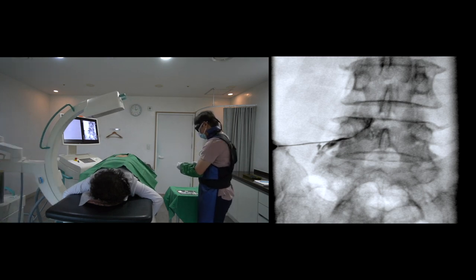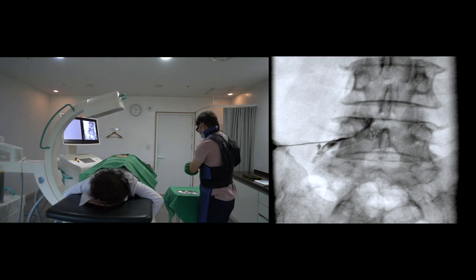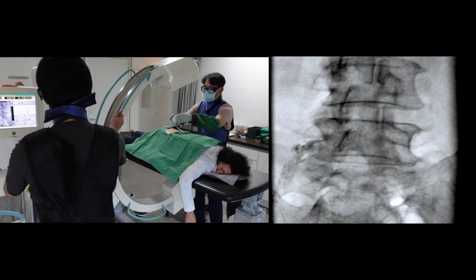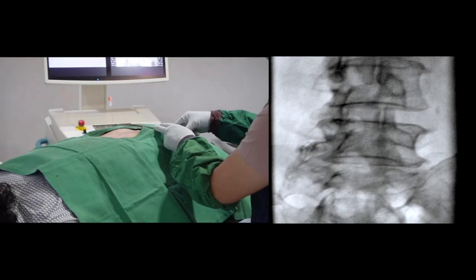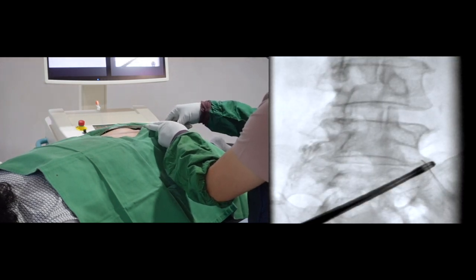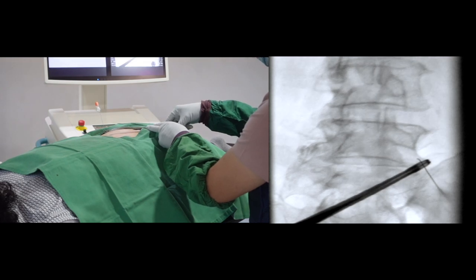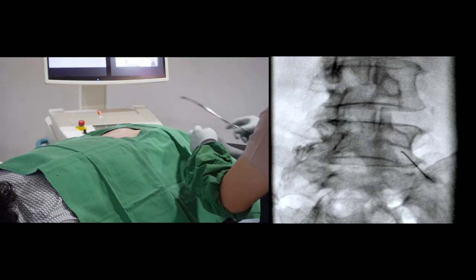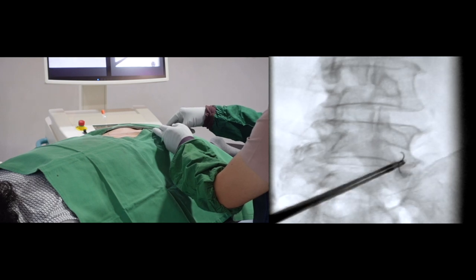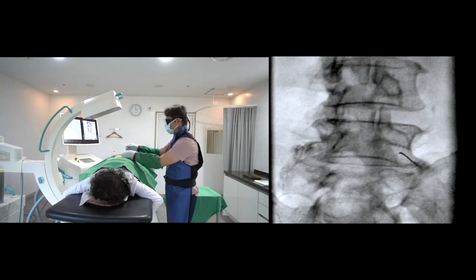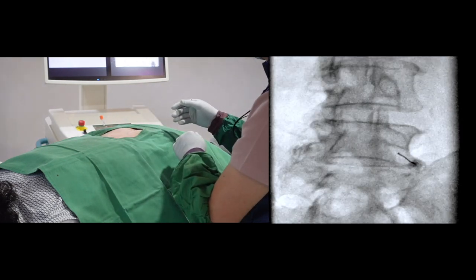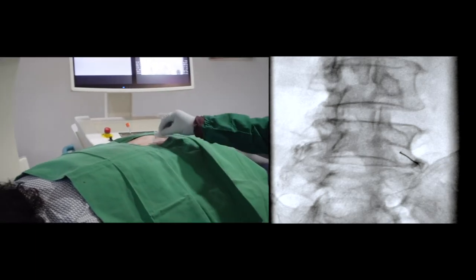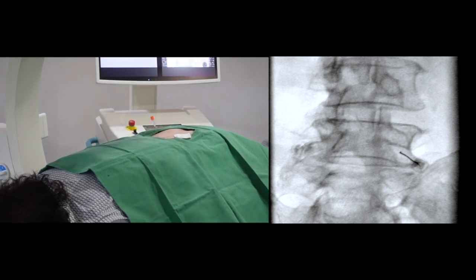Moving to the right ipsilateral oblique view — I may have to ask for more angulation than expected. The procedure for the right side is more challenging to control because I must move the needle from outside to inside. I should focus on needle orientation, considering the degree of the C-arm oblique angle and cranial tilting angle while watching the needle and needle shadow. Long placenta forceps are very handy to reduce radiation hazard. I can control needle direction by twisting, gentle pushing, and sometimes bending the needle shaft.